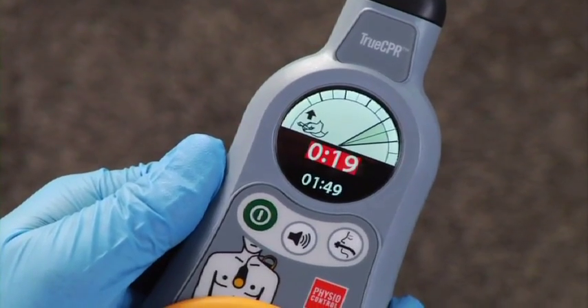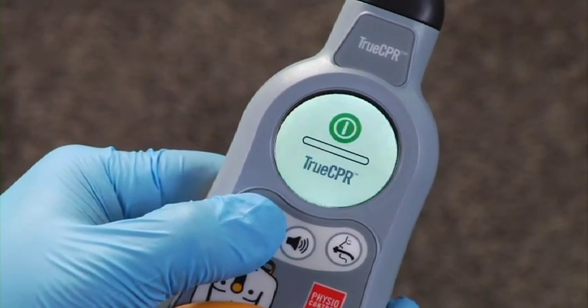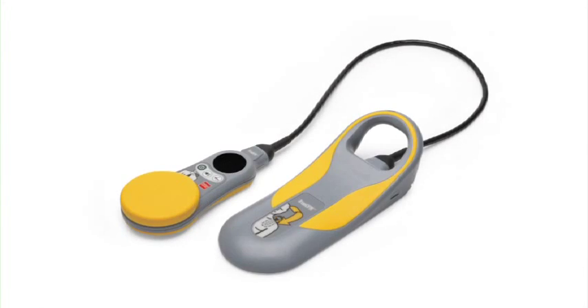To turn off TrueCPR, press and hold the power button for two seconds. A progress bar appears while it's shutting down. Let's take a look at some screens you might see if you have to troubleshoot.